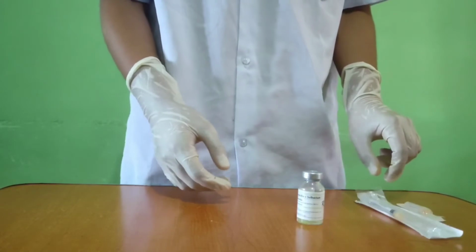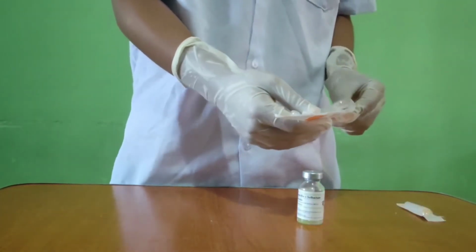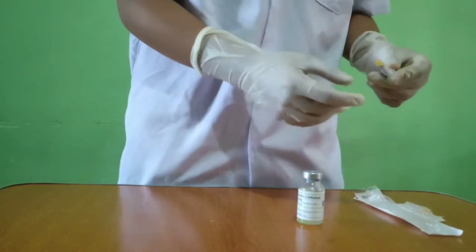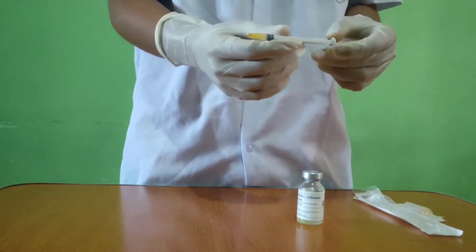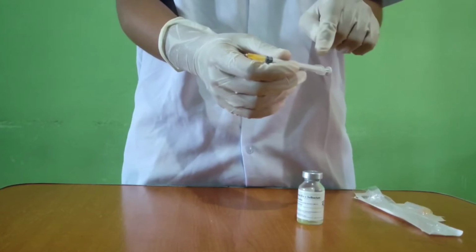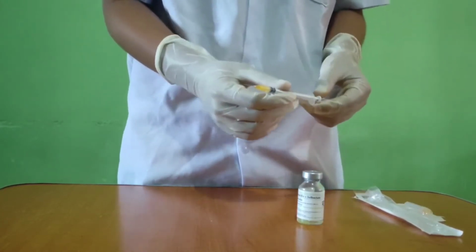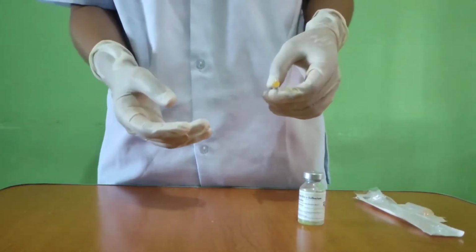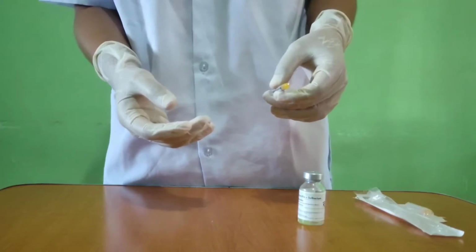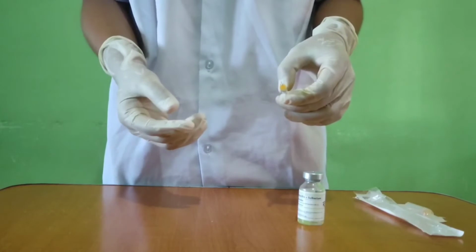After that, get the syringe, specifically the tuberculin syringe, because I'm doing the procedure of intradermal injection here. Also, make sure that you don't touch this part of the syringe. After that, we're going to draw back air, and the amount of air will equal the amount of fluid we're going to take out of the vial.